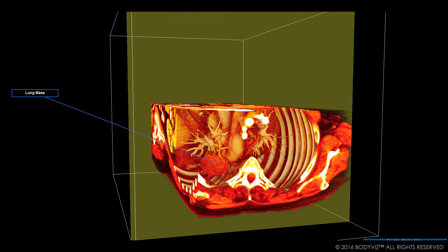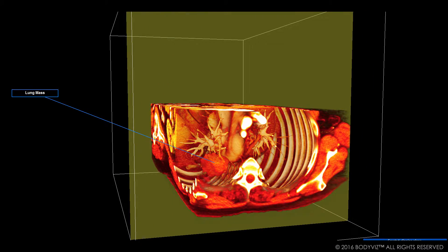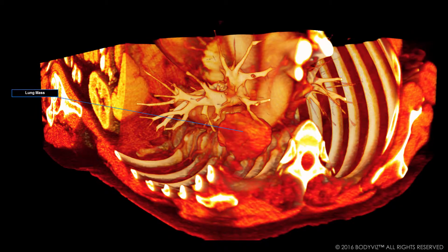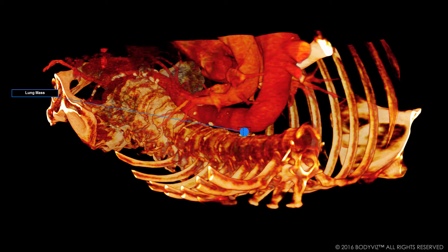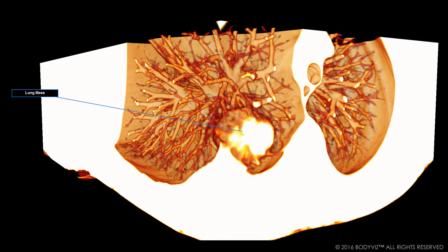Now that we can see the mass better, I'm going to change the tissue type. Tissue type mode in BodyViz allows me to view the patient data through lots of different filters based on body tissue density.